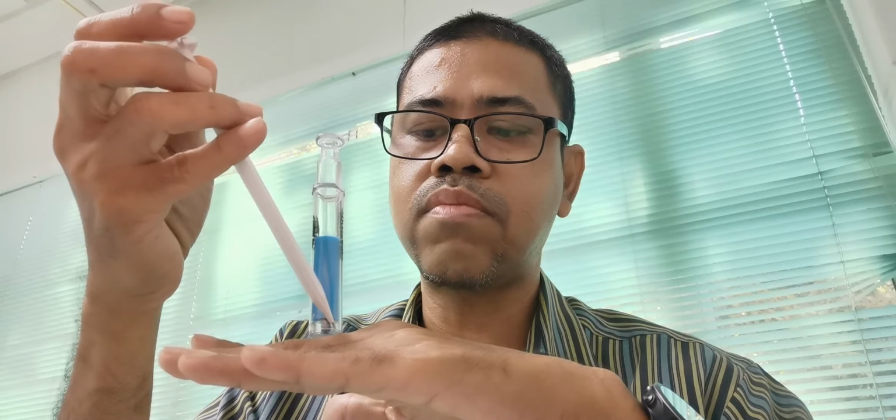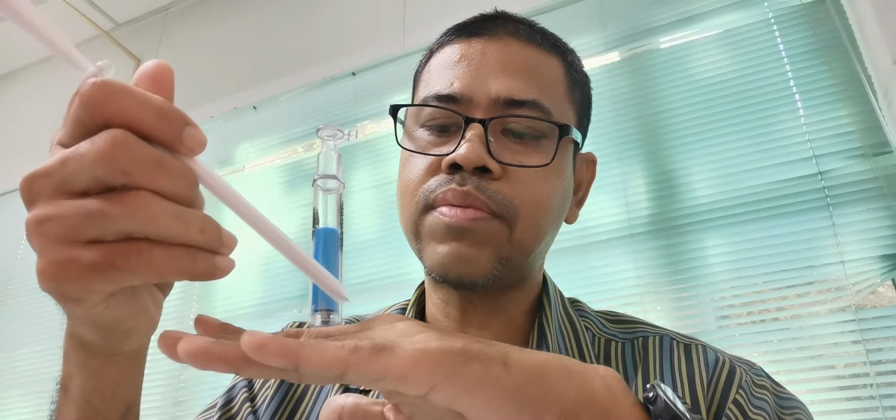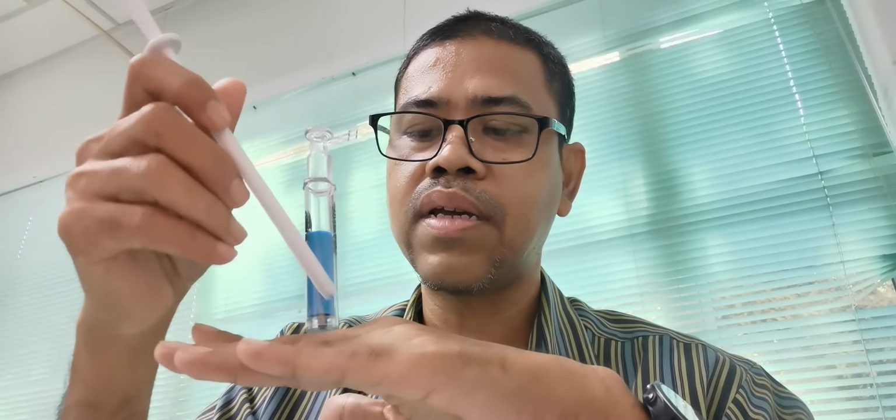After you give local and you see urine come out, just make a small incision next to the needle. The surface landmark is still 1 to 2 cm above the pubic symphysis. Make a small incision with a size 11 blade, and then you puncture this Cystofix upright at 90 degrees, with control.